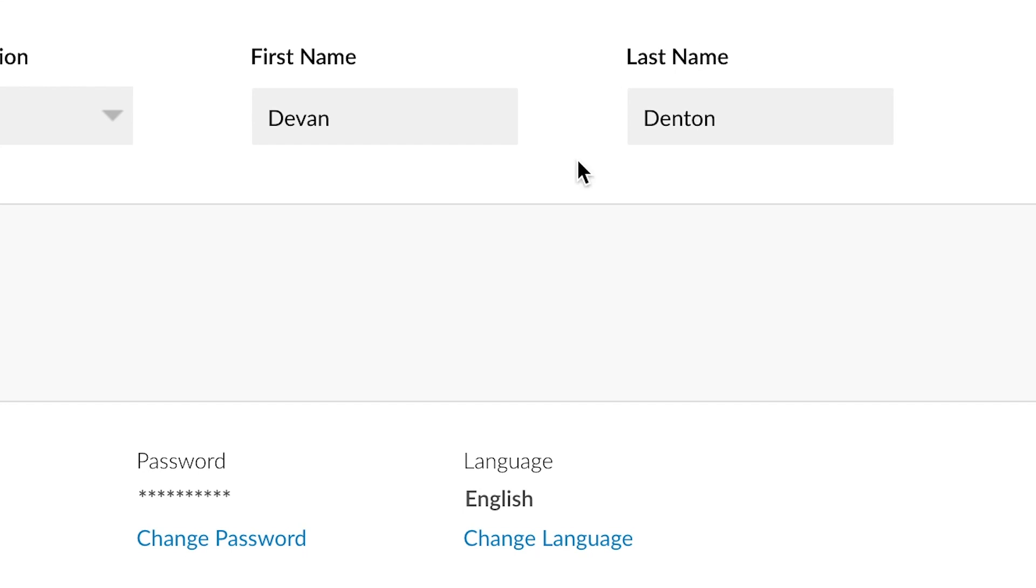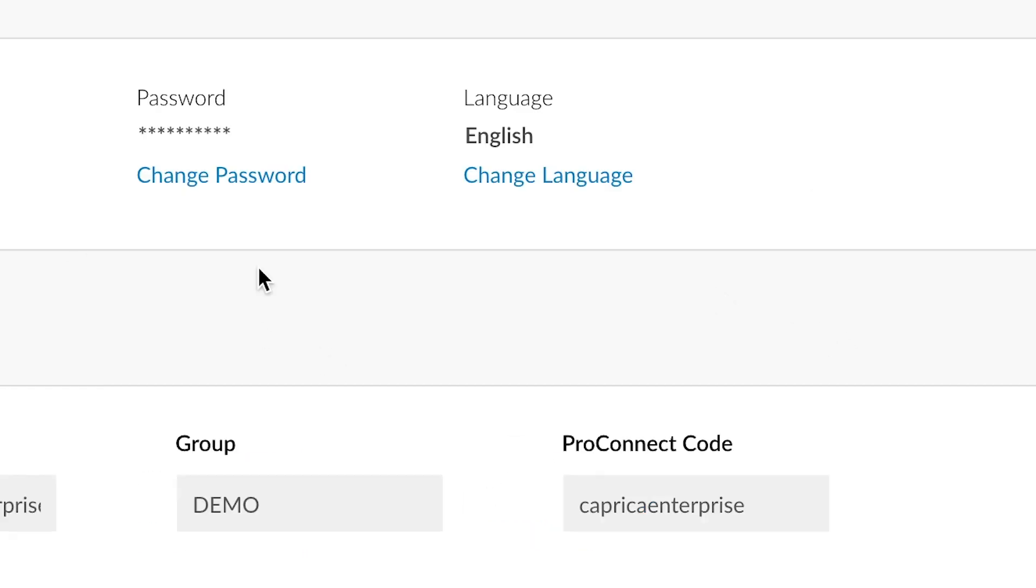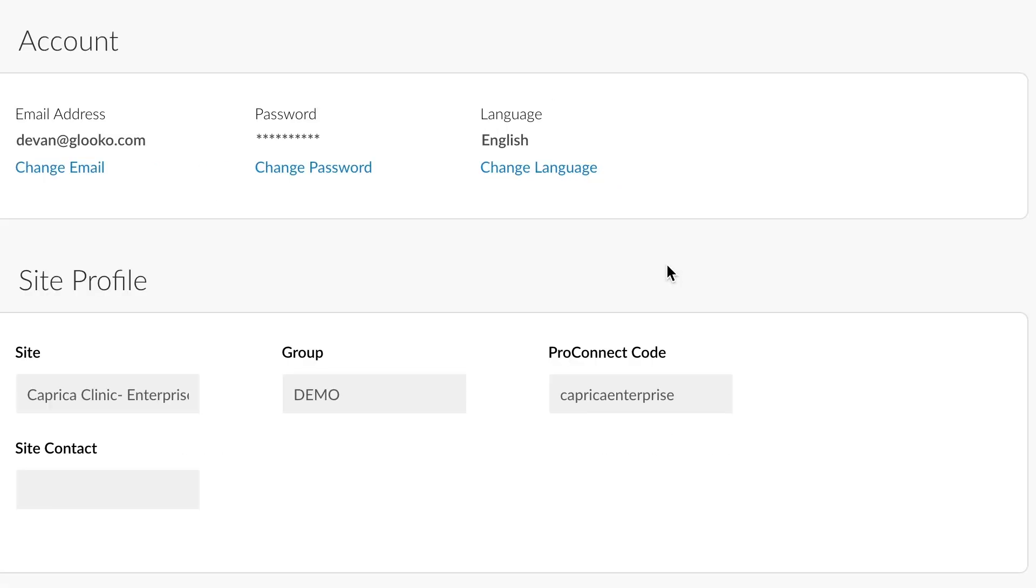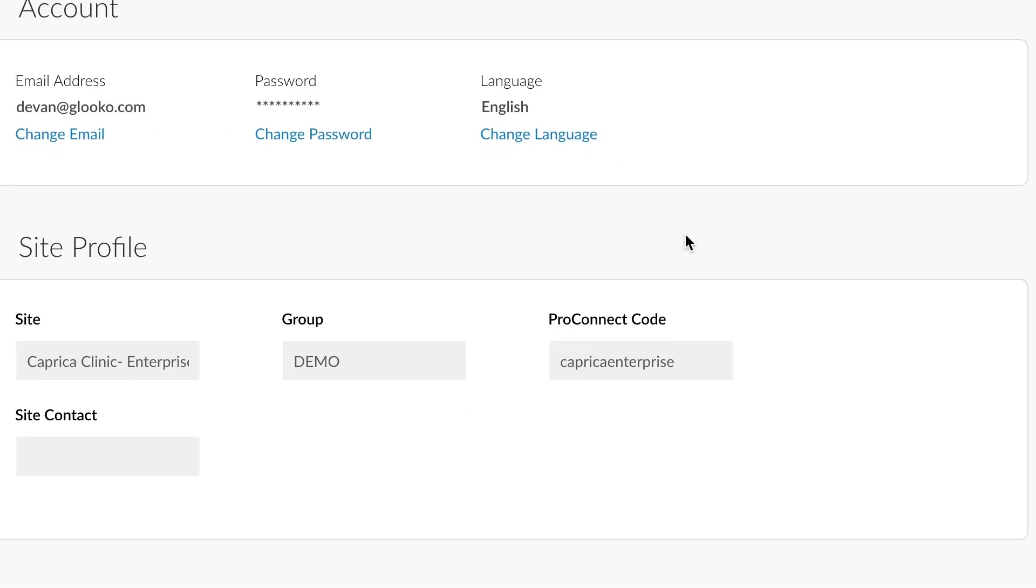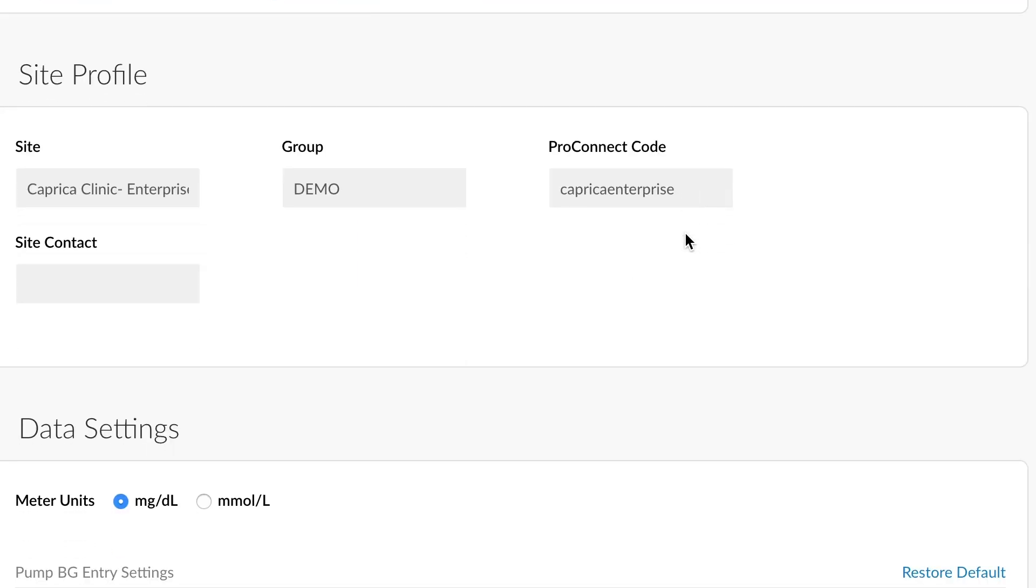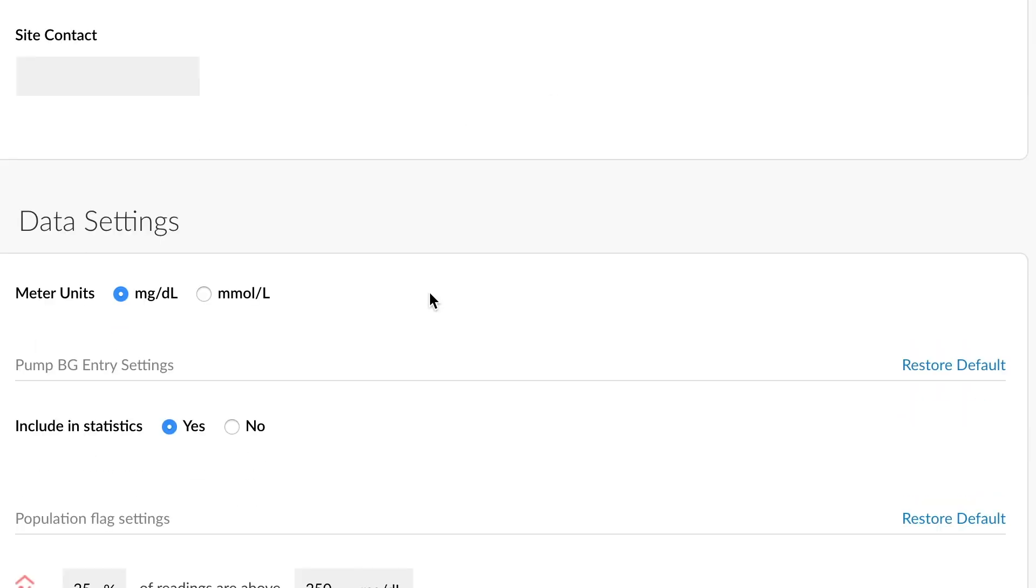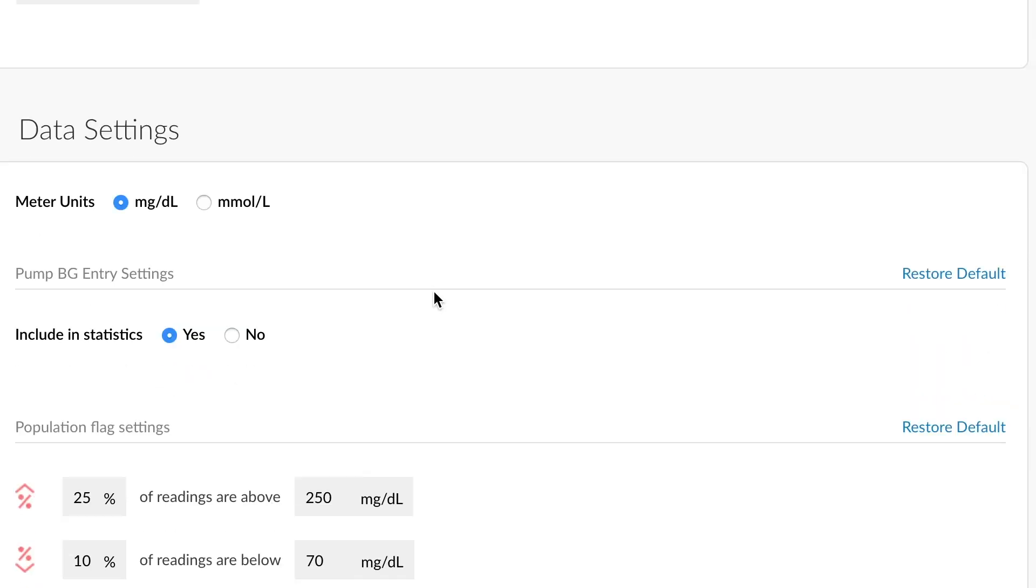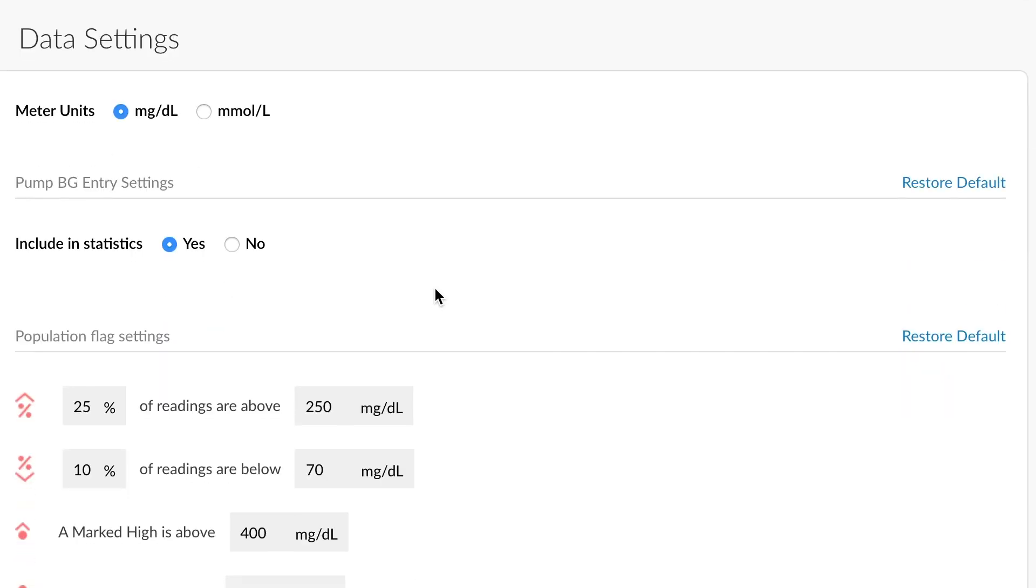Going to Settings will allow you to make changes to your profile. From my profile, I could change my designation, my first and my last name. I could even modify my login email address or change my password. Scrolling down further, there is some information displayed in the site profile, another place where you can find your ProConnect code or the name of your account.